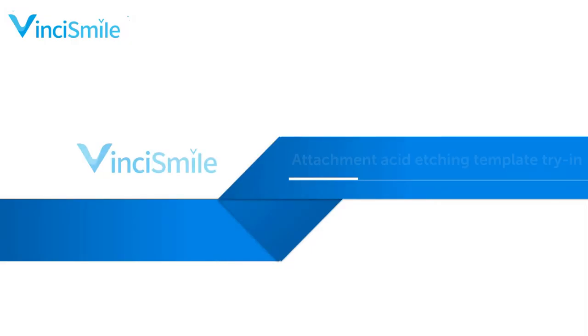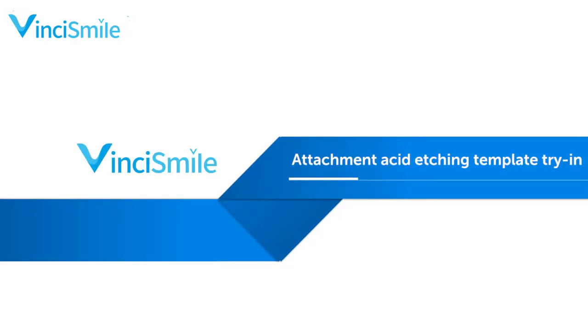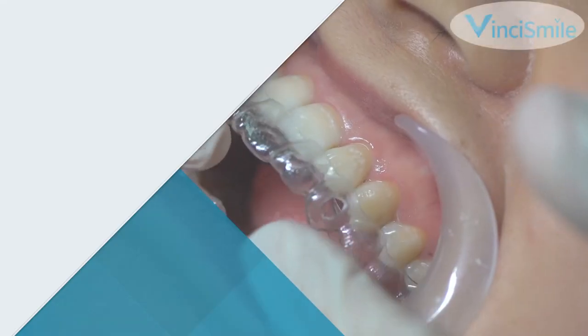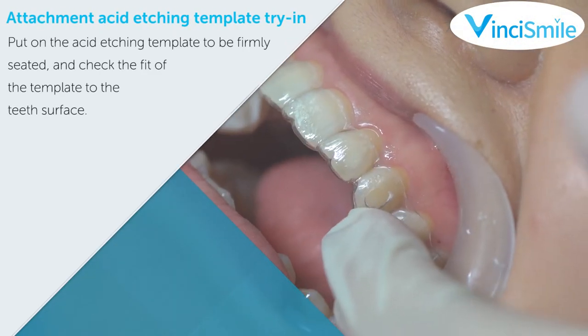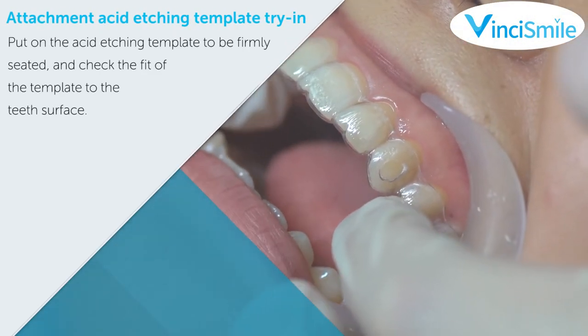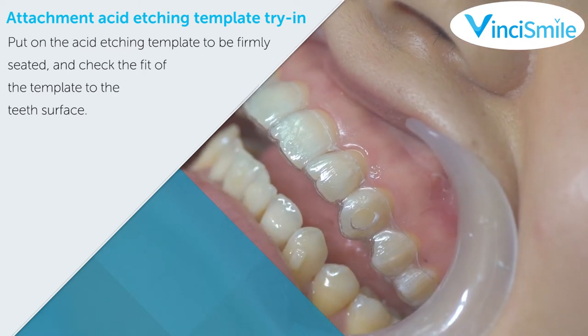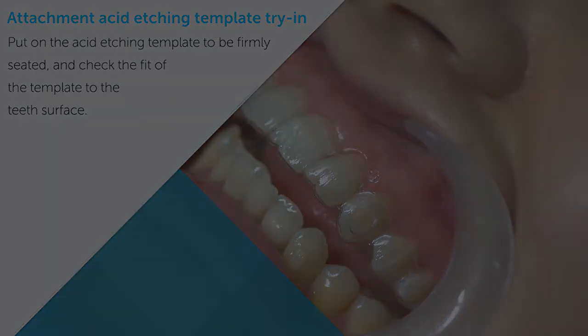Attachment acid etching template try-in: put on the acid etching template to be firmly seated, and check the fit of the template to the tooth surface.